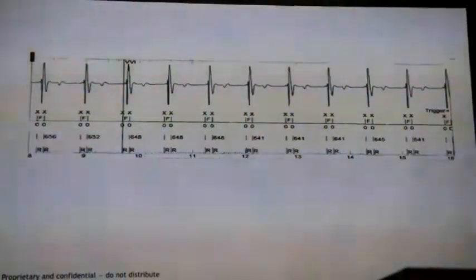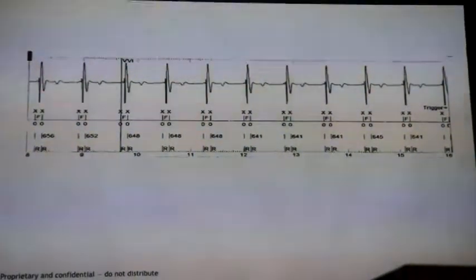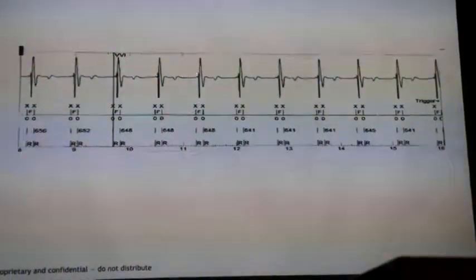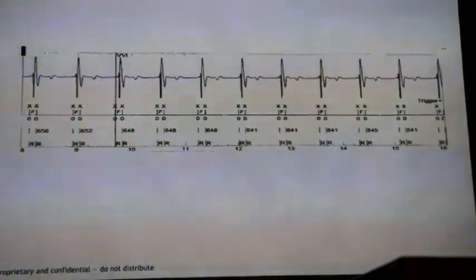If this is an implant, we want you to move the lead. This is not an implant. And how much is the R wave measurement here? The R wave here was big actually. It's a big R wave. It was like a 12 millivolt R wave.